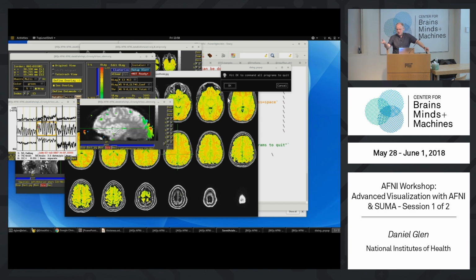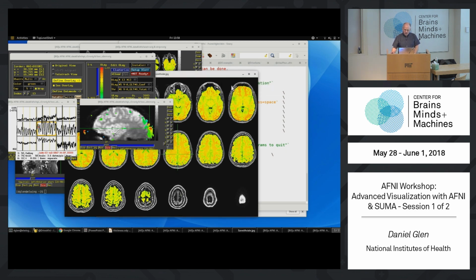This is a tcsh script usually, and it's not Python and it's not compiled C code. But it is just an example. It is one of the more unusual things in our distribution, that it's really made for specific data. Probably shouldn't be there. It should probably go with the data, I think. But it's such a good example that most people will need to see it. Okay, so good question. Thank you.